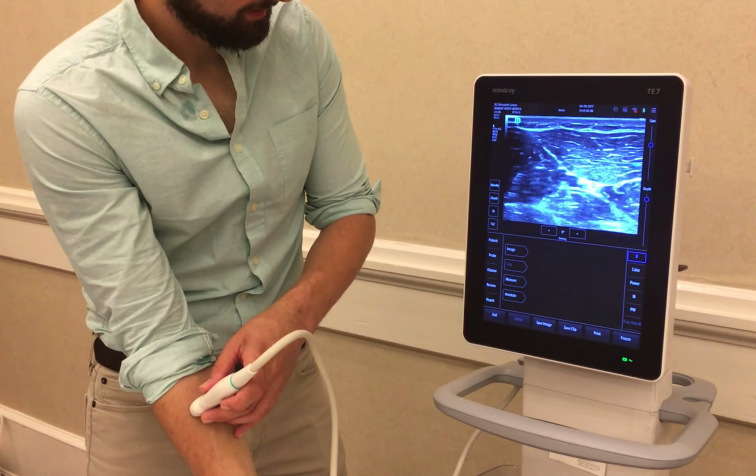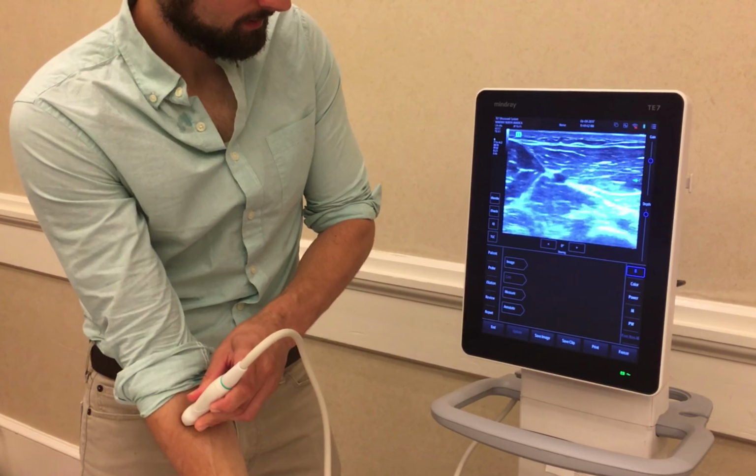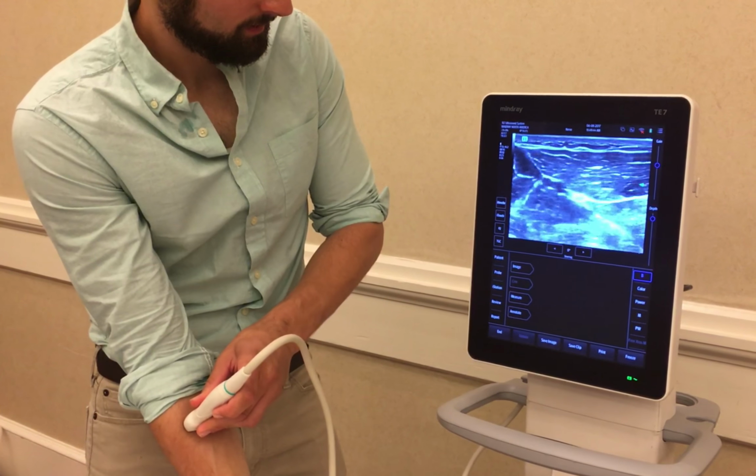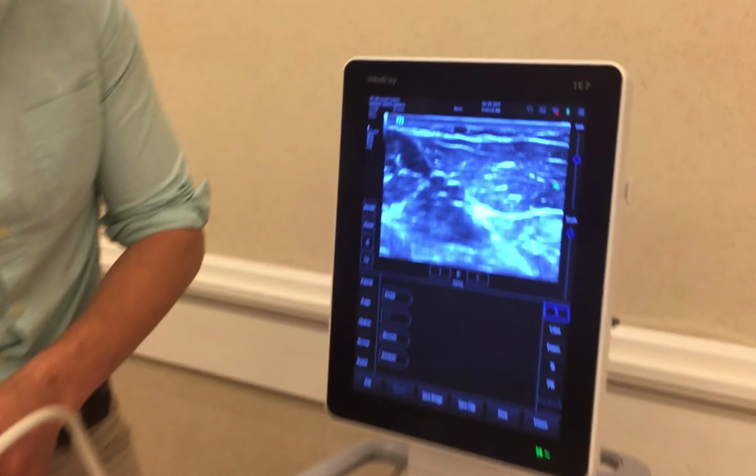So here I am demonstrating the fact. I'm probably a little bit volume behind. I got a little bit of exercise in before the lecture, just drank coffee all morning, and this was done at like 1:30 in the afternoon. So I probably could use a little bit of hydration.